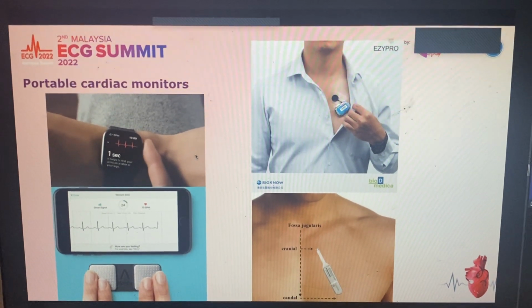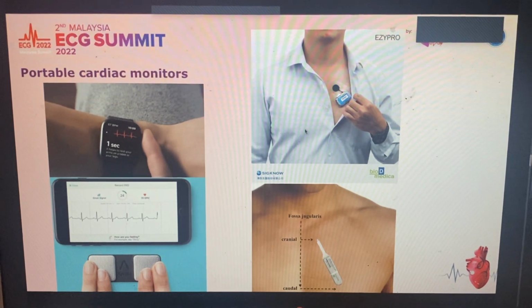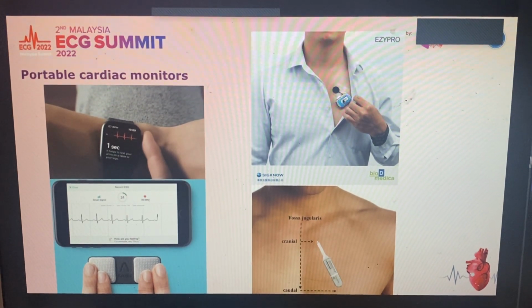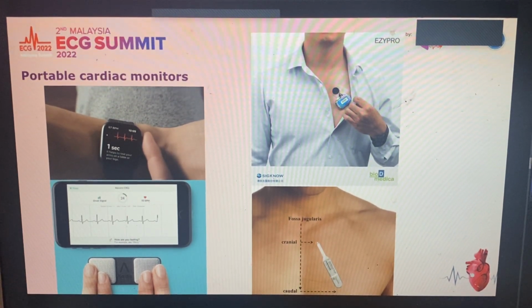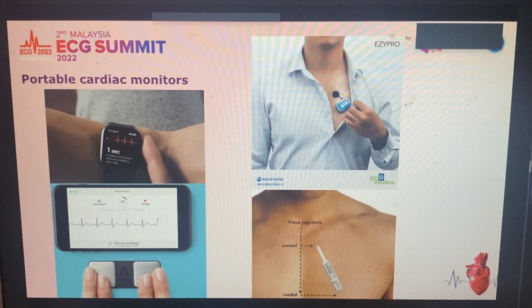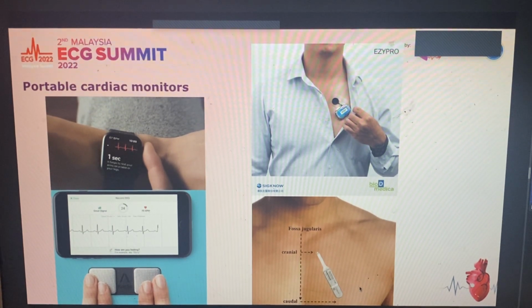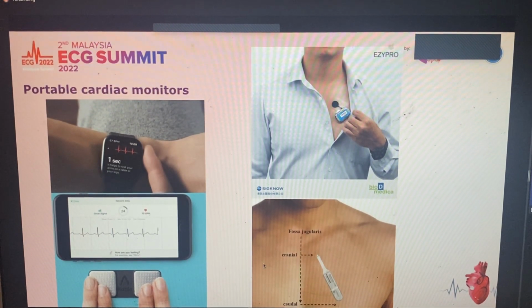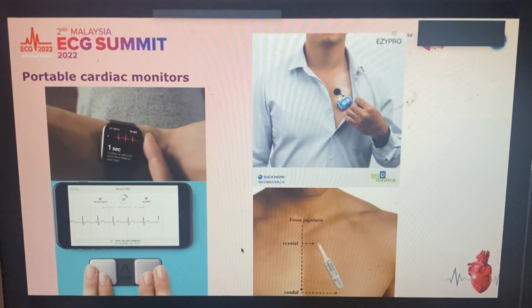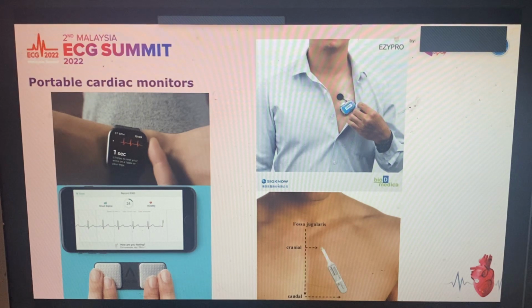Nowadays we have a lot of technology. We have the Apple Watch, we have Cardia Mobile, we have a 1-week portable cardiac monitor with a patch on the patient, which generally measures lead 2, and we have an implantable cardiac monitor placed subcutaneously to monitor the patient for up to 3 years, whether investigating for tachyarrhythmia or syncope, or for whatever reason the patient needs it for.